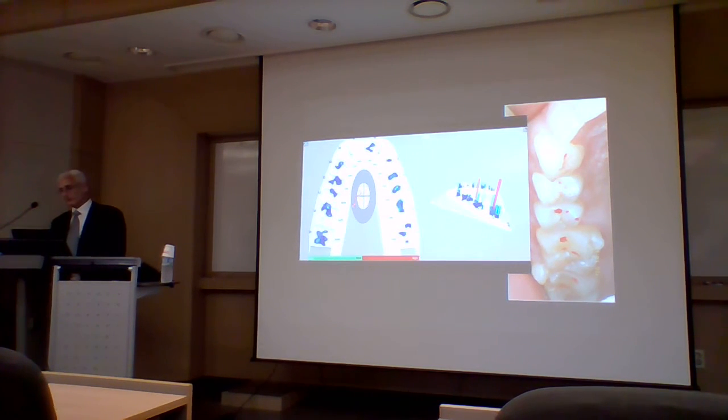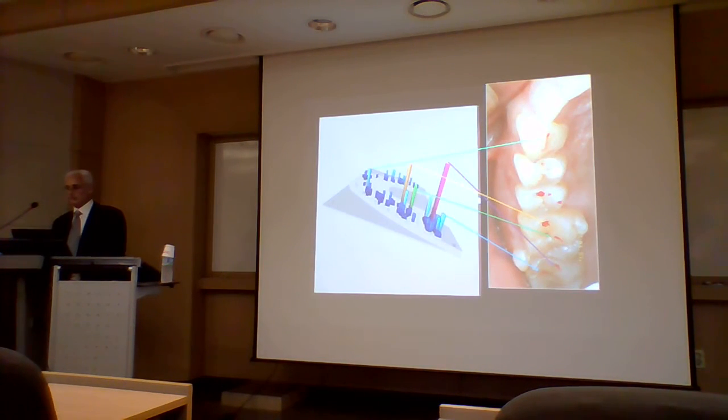And you can see the variability in the forces, which we match them up to the paper marks. The largest ones aren't the most forceful. There's a tall one, not the biggest mark. There's a large one, it's moderate force. So there's variability in the sizes and there's variability in the force.